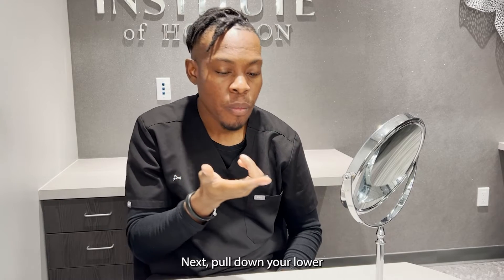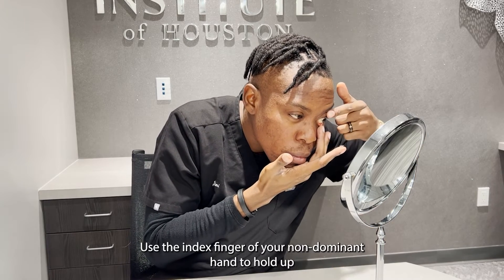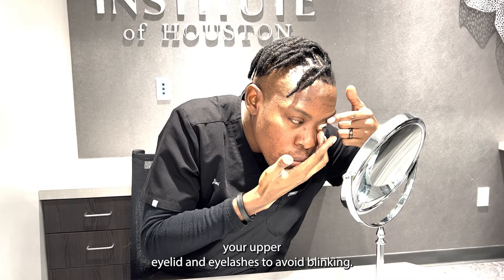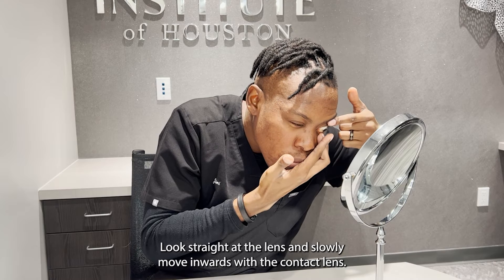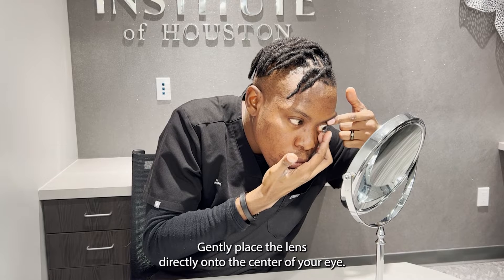Next, pull down your lower eyelid using the middle finger of your dominant hand. Use the index finger of your non-dominant hand to hold up your upper eyelid and eyelashes to avoid blinking. Look straight at the lens and slowly move inward with your contact lens, then gently place the lens directly onto the center of your eye.